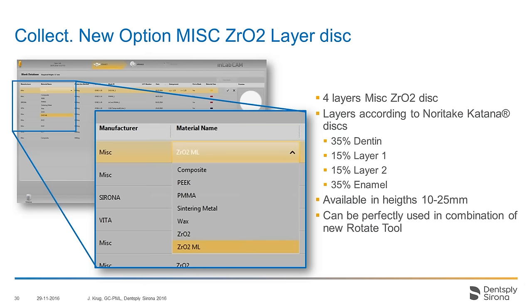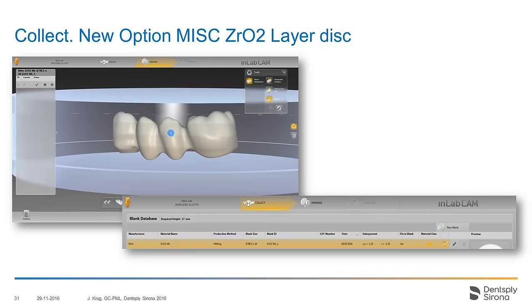We have also added a layered zirconium oxide disk which is based on the layering of the Noritake Katana disk. You will not find Noritake as a material brand in the software yet, but if a user wants to use this disk they can use the Zirconium Oxide Multi-Layer from the Miscellaneous selection, and the layering is based on the Katana layering. As you can see in the next slide, it will show all the different shades of the layers in the puck and the user can position the restoration according to their needs.